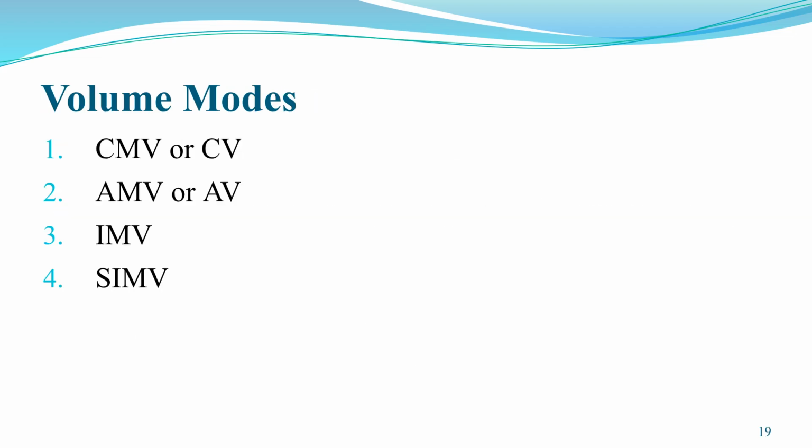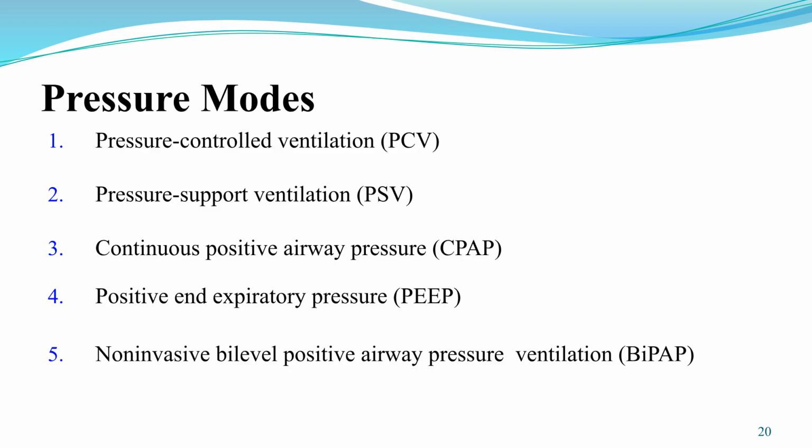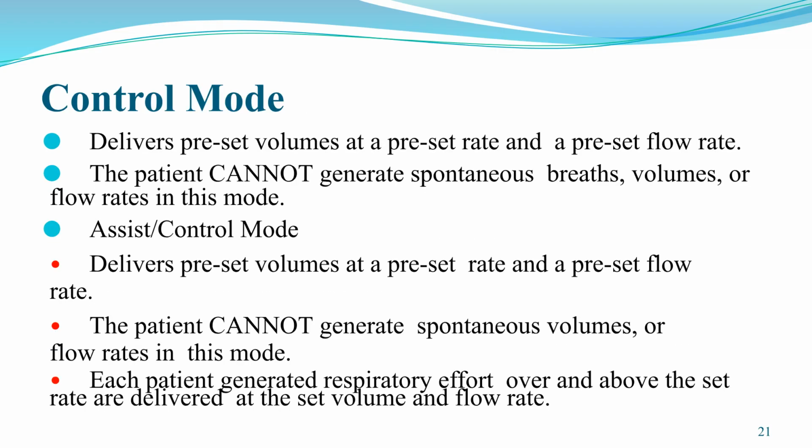Volume modes of ventilation include controlled mandatory ventilation, or CMV, assisted mandatory ventilation, or AMV, intermittent mandatory ventilation, or IMV, and synchronized intermittent mandatory ventilation, or SIMV. Pressure modes include pressure-controlled ventilation, pressure support ventilation, continuous positive airway pressure, positive end expiratory pressure, and non-invasive bilevel positive airway pressure ventilation.